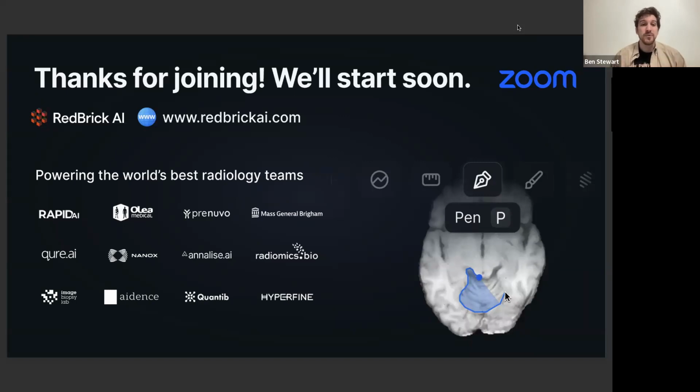But I can generally speak to what RedBrick AI is, what we do, strictly what we're selling, maybe to just clear some things up before we jump into a live demonstration of the product itself. So RedBrick AI is functionally two things, right? We are an annotation tool. As I mentioned, we are a medical tool, specifically for medical applications.